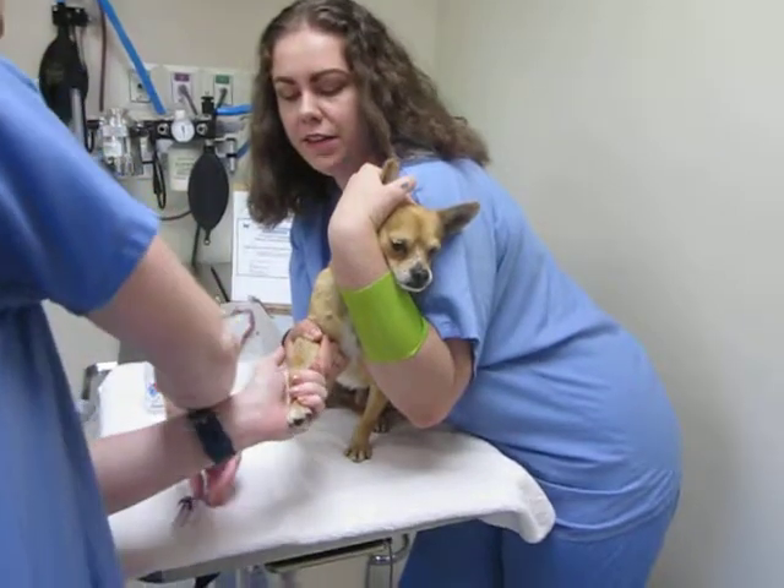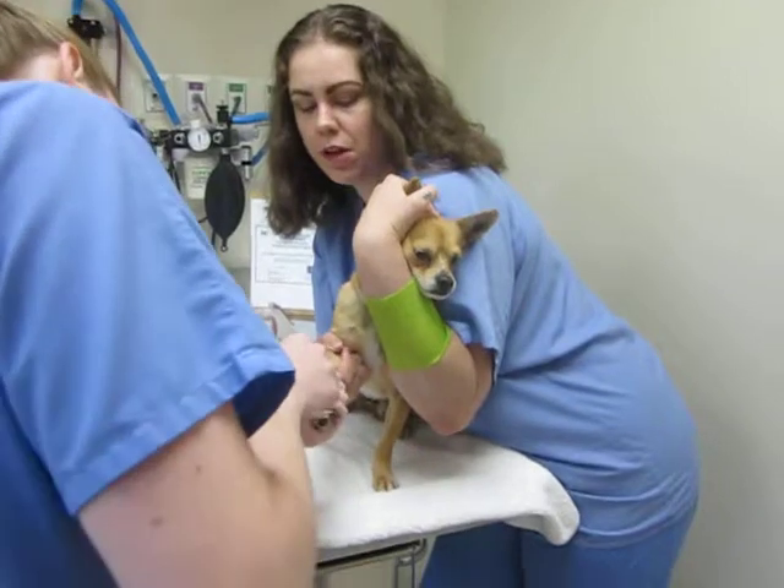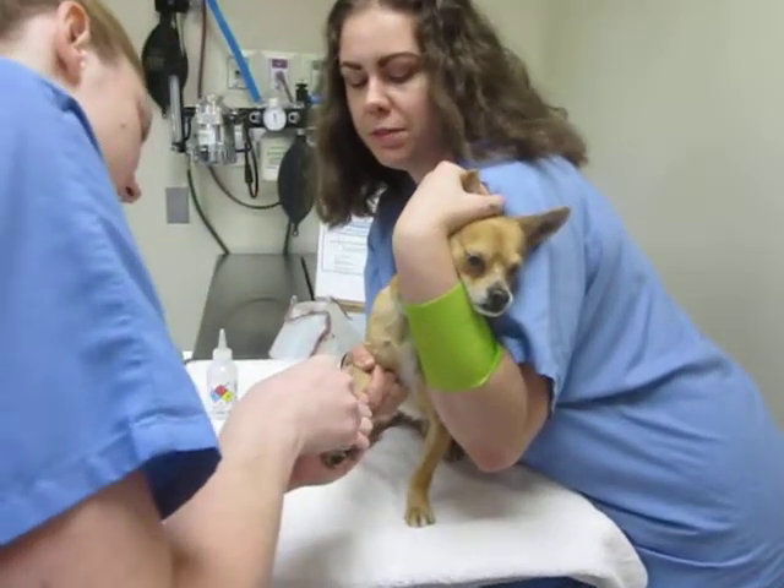Unlike giving an injection, once we have a flash of blood in the syringe, I'm going to continue to hold off until we have an adequate sample size.